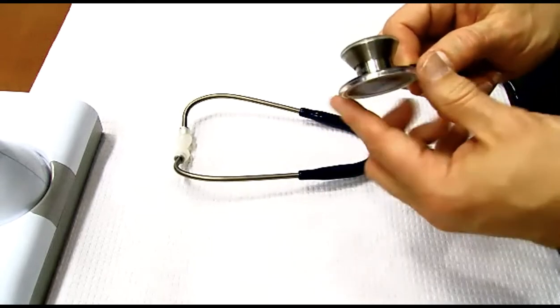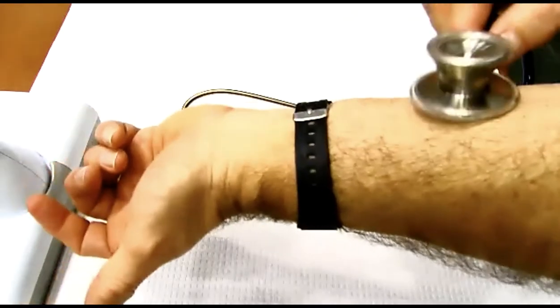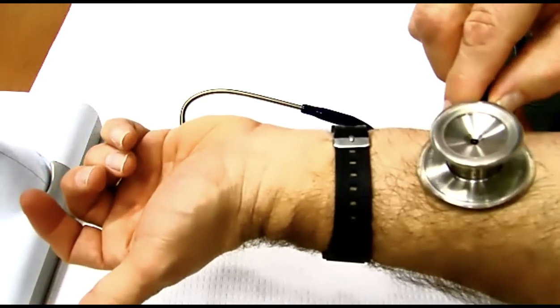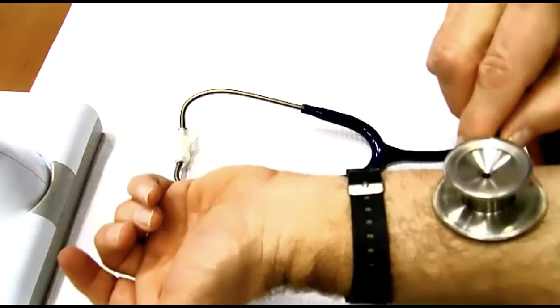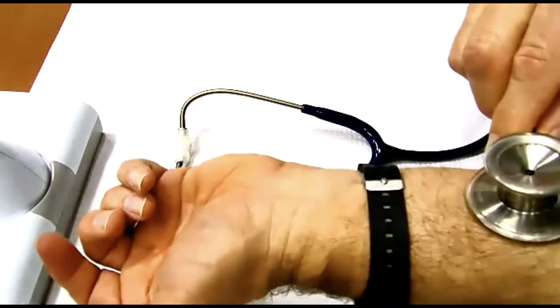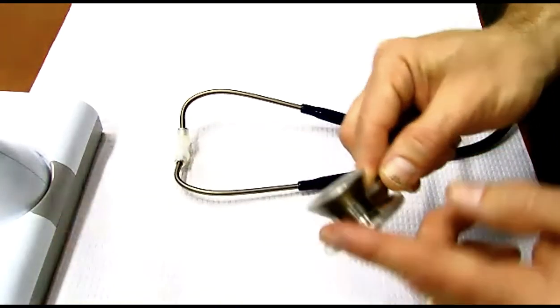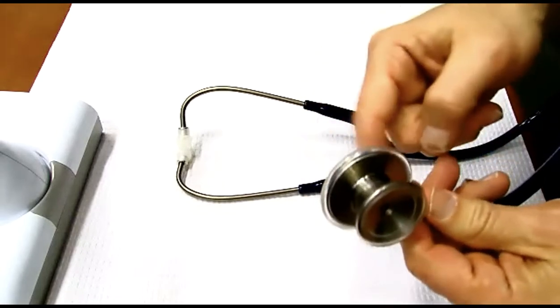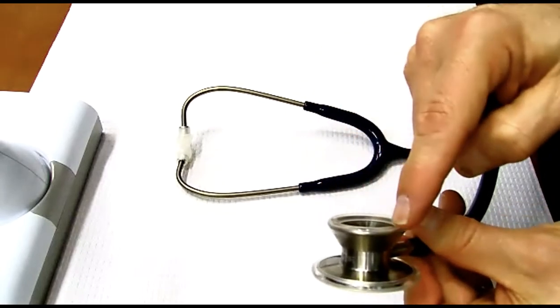The diaphragm is pretty sensitive, and it's also a little more forgiving on location because it's got a wider area. You can be off a little bit and still be able to hear it, okay? So there are some advantages. The disadvantage is that any movement at all and you'll be able to hear it, so it'll cause problems. So the diaphragm, I would say more than half prefer that. But here's the deal: people that struggle with the diaphragm, the bell often helps them a lot.